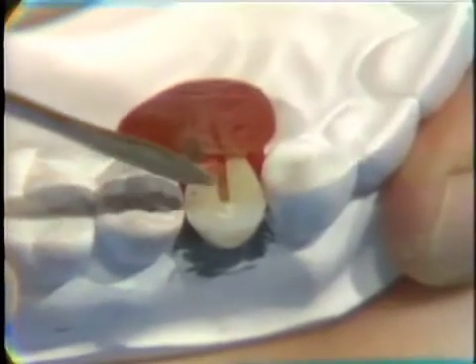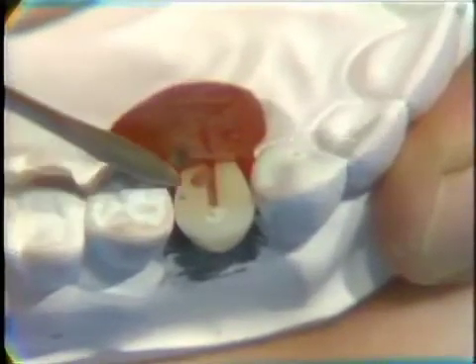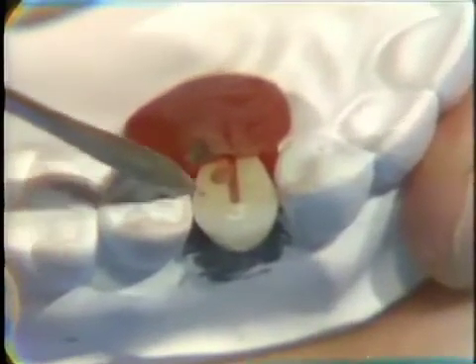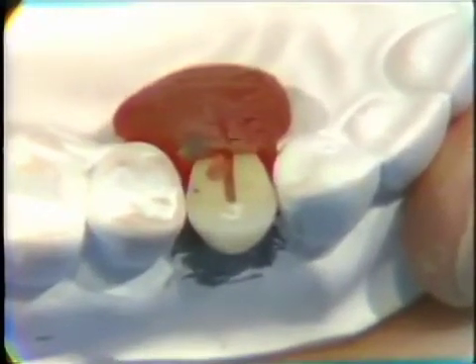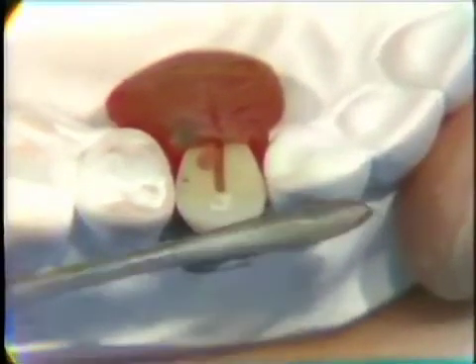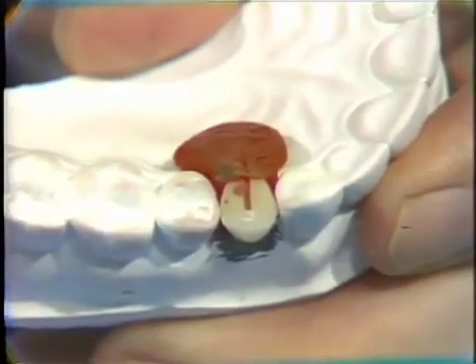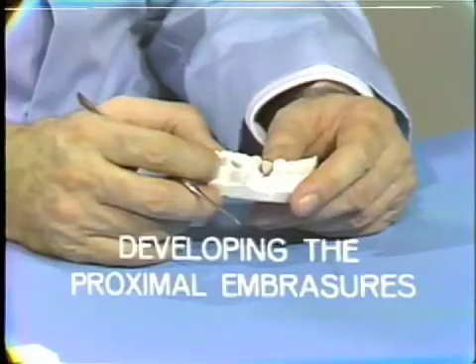And what we will do in this case is to put a bevel actually along here and along here in order to get an extension of gold down to enlarge the area of contact with the adjacent teeth so that our connector development will be a little easier. In this situation, that is going to be necessary. I think, too, you can notice the buccal alignment of this thing so that the buccal surface is aligned with the adjacent teeth correctly. The next step is developing the proximal embrasures.